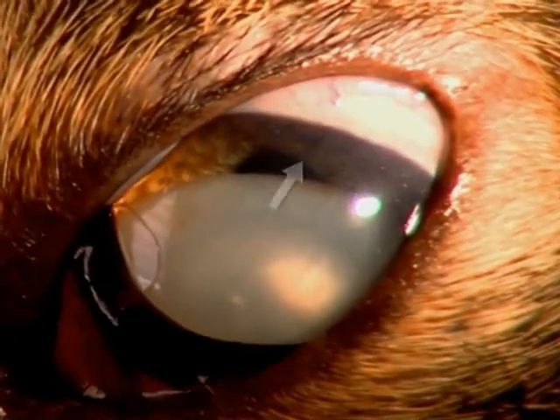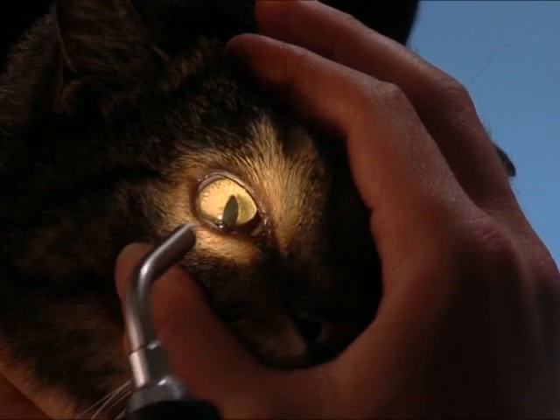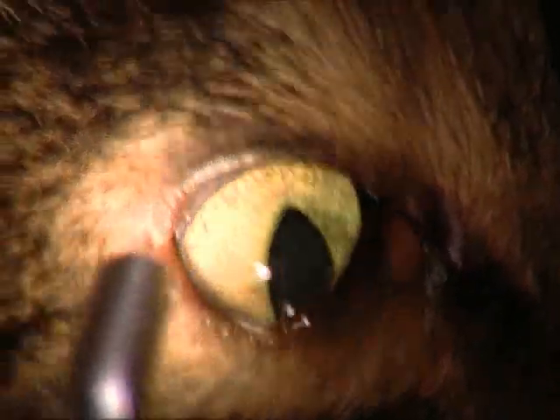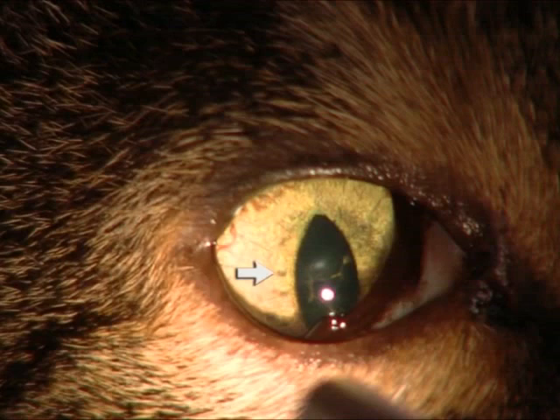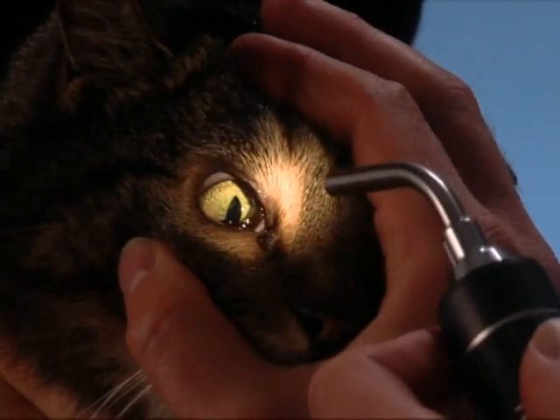Under illumination, deep corneal vascularization is apparent. The right eye shows little redness. However, small grey spots in the iris and changes in the lens are consistent with past inflammation. These findings are suggestive of chronic uveitis.